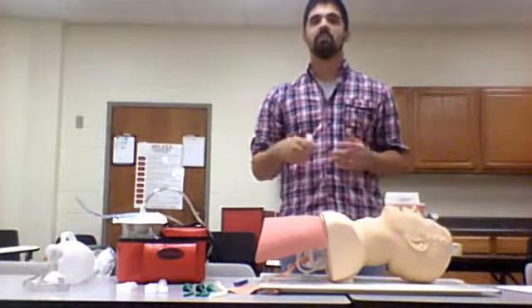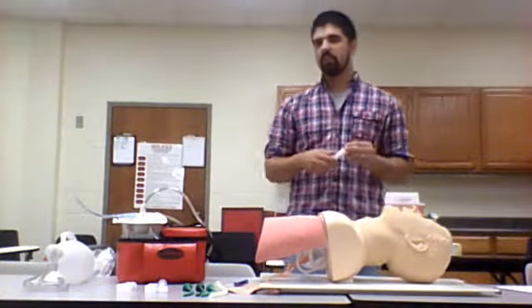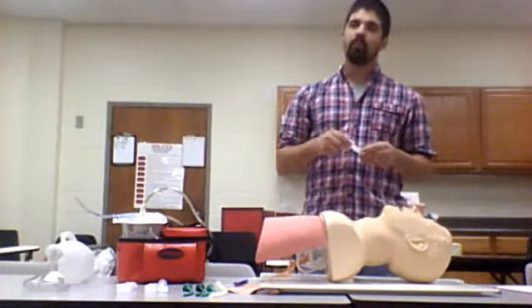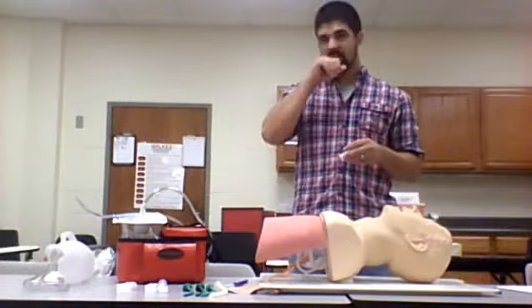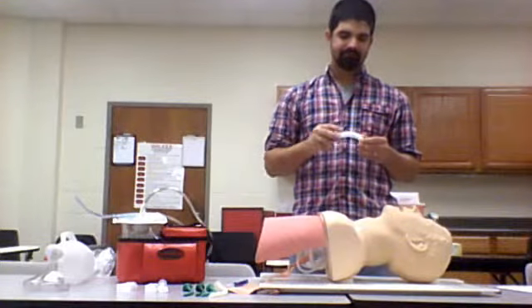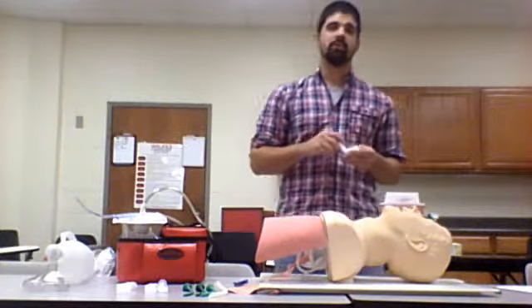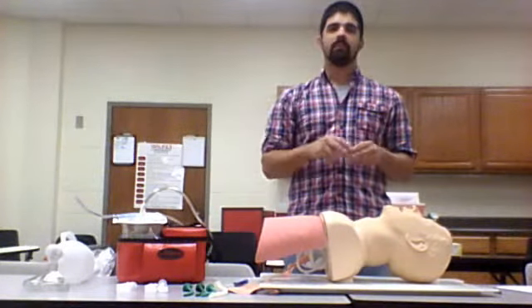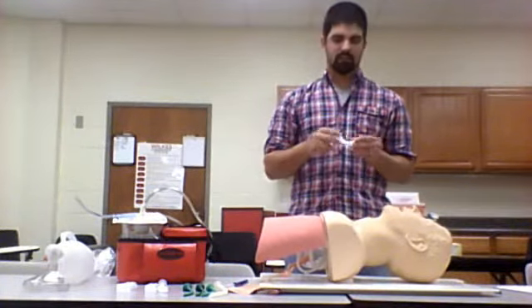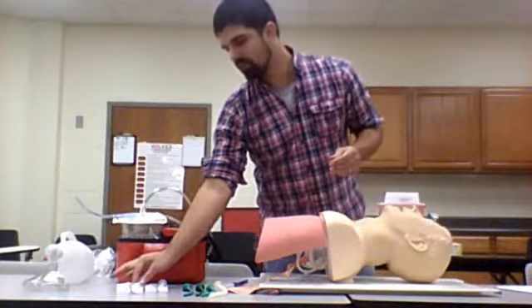Now, the tongue is the most common cause of airway obstruction in an unconscious person. So this is a big deal and a big issue for us, and this is a great tool. But you can't always use the OPA. When you can't use it is someone who has a gag reflex. They could be unconscious but still have a gag reflex, and that's when we don't want to use this, because the last thing we want to do is cause someone to aspirate vomitous material, causing pneumonia, and that's not going to be too good of an ending potentially for them.